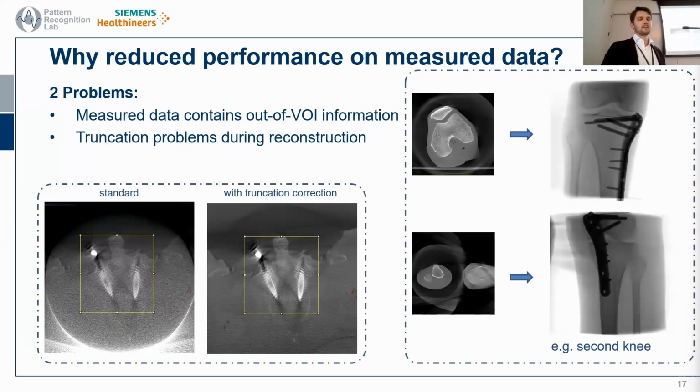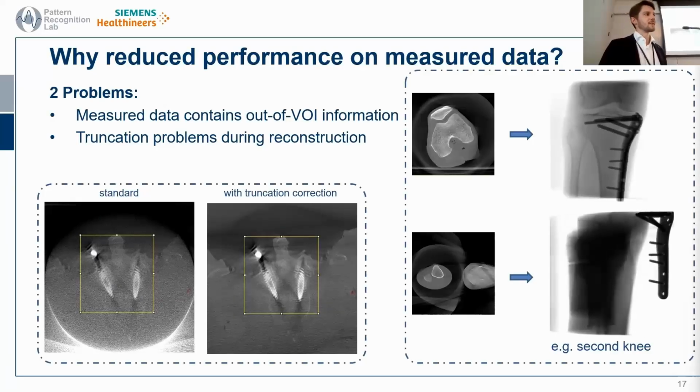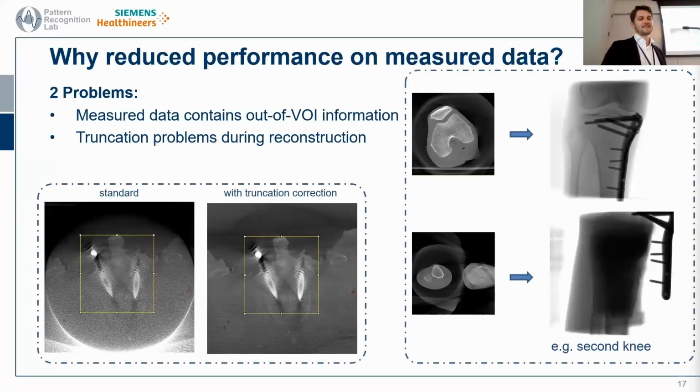And we're currently investigating methods to, was that your question? Yeah. I really think if you're able to circumvent that problem by adapting the ramp-like filter that's currently implemented in the model, that should do enough. But I would have to test it out.